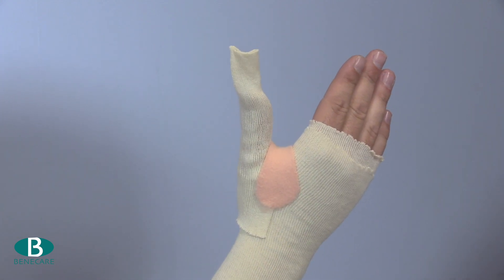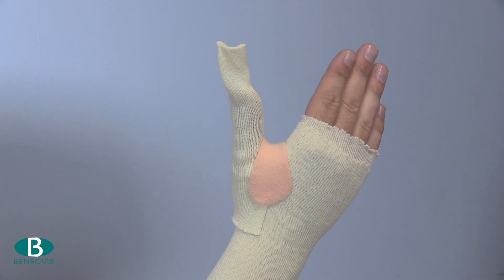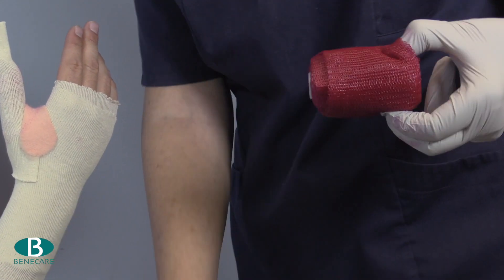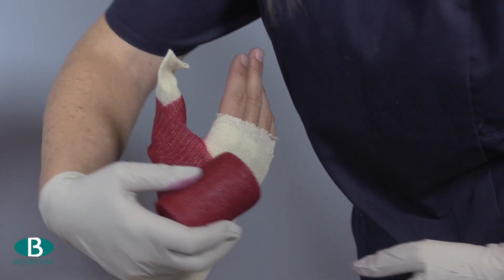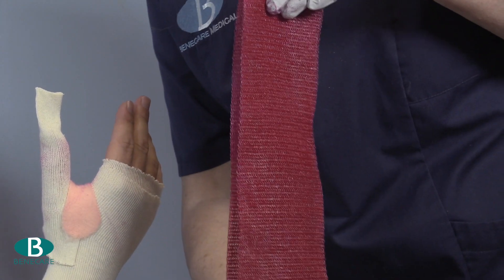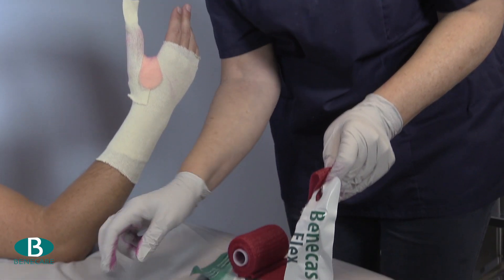Apply your gloves and using Benecast Flex 7.5cm make a 2-layer slab. Measure from the centre of the palm around the thumb to the centre of the hand on the dorsal aspect. Fold this to create a 2-layer slab and then make a 2cm cut in the centre of the slab.